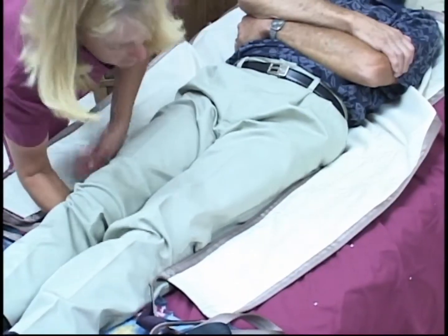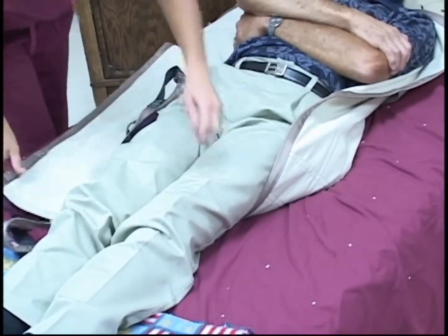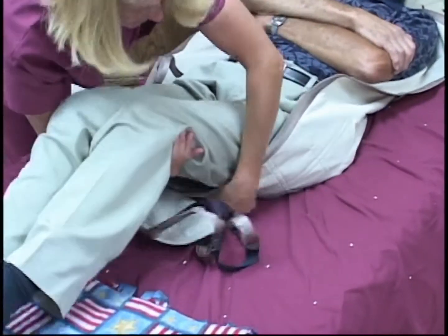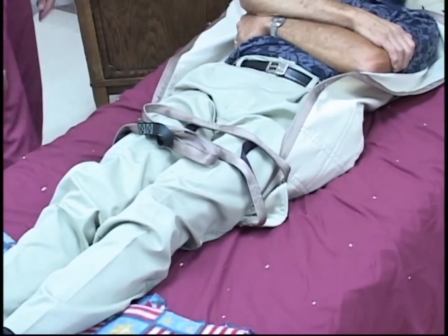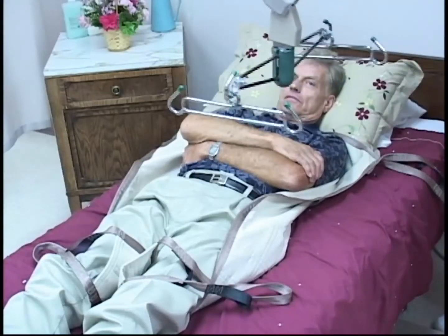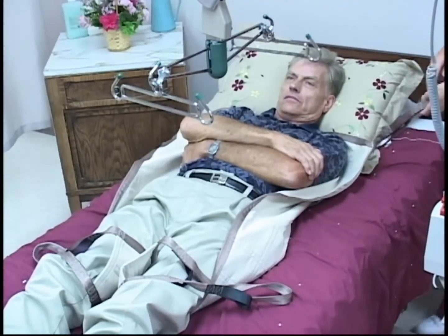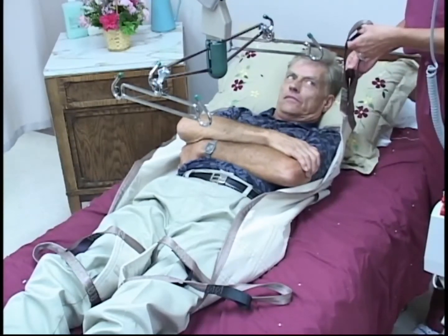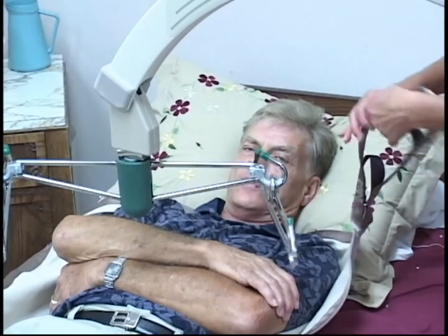Note, if the patient's legs are extremely rigid, it may work better to bring the left wing under the right thigh and the right wing under the left thigh instead of going between the patient's legs. Position the lift until the green rubber hose is over the patient's chest. Make sure there are no cords or other objects under the bed that would obstruct the wheels of the lift.